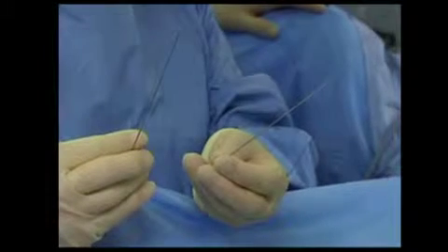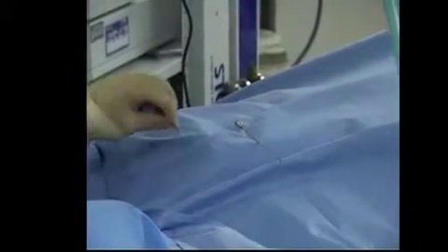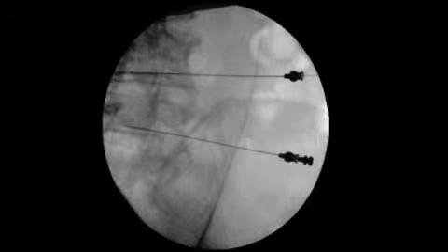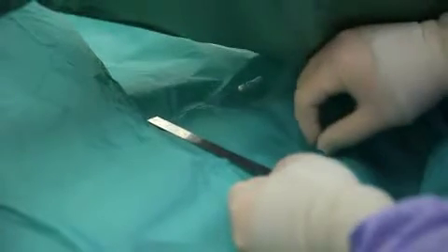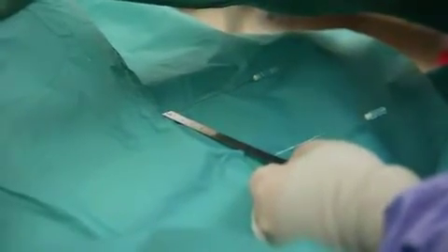And now we will use needles to be put on the surface of the drapes to identify the length of the stricture. First needle is in place, second needle is in place, and we can verify that on the II. You can see now the length of the stricture on the II, and this is a decent length stricture. Now we are doing the measurement, and this measurement is going to be very important that it's done accurately, because this is going to determine the length of the Memokath that we will be using.